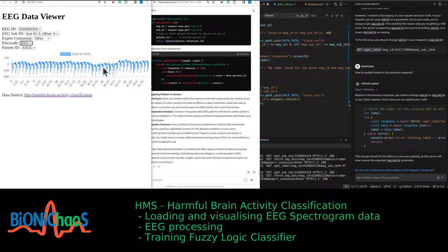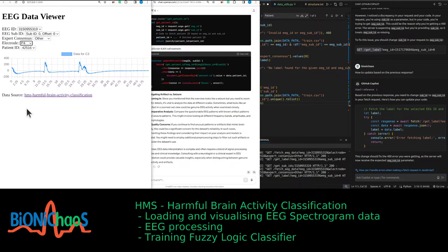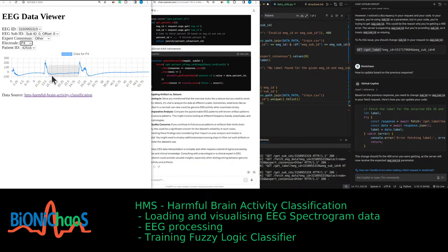ECG is there. The fact that it's inverse should not matter. It's fine. But then, this is what's happening on the left side of the head, and this is on the right. It's just a major artifact. And I have a lot of trouble with those labels.